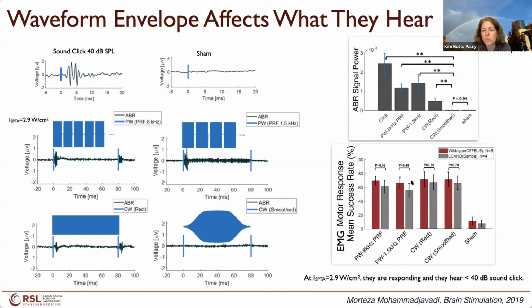Very high success rate for all of these different waveforms, including the smoothed waveform, and that was no different than the others. So that was saying to us that, yes, they were responding, and it wasn't due to the sound. We're not saying that they don't hear something. It's very clear they hear something, but the response wasn't due to the sound itself. So that was sort of our conclusion.